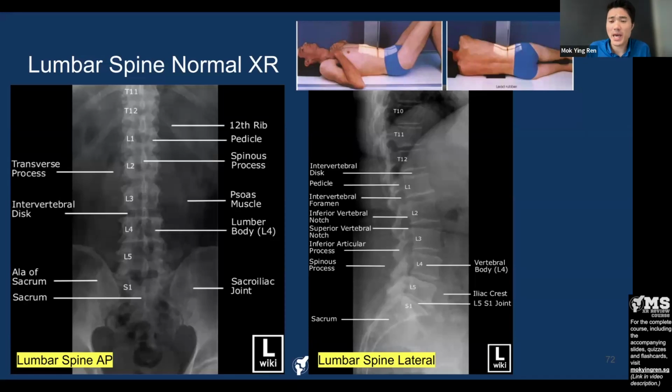All right, and that can be done perhaps in an X-ray that allows you to see the whole spine, or even in advanced imaging like CT, MRI. The gold standard is still counting from the C2. All right, but the surrogate here is to count from distally. Just be aware of this limitation. All right, or if you are asked in the exam, what if there is this lumbarized or sacralized vertebra? Then your response is that you want to take a full length spine X-ray and then count from the C2 or look at the advanced imaging.